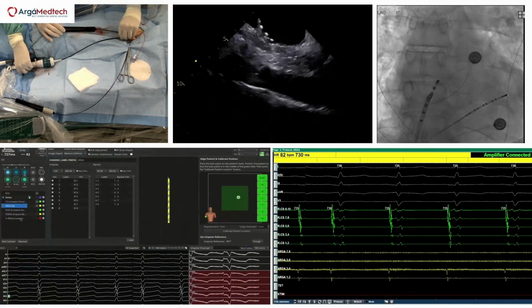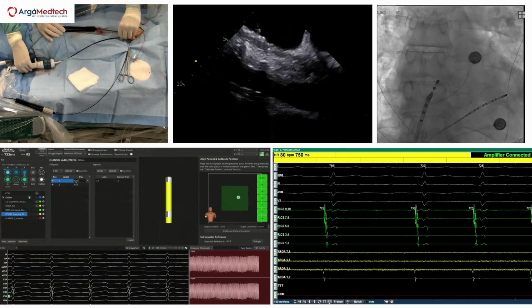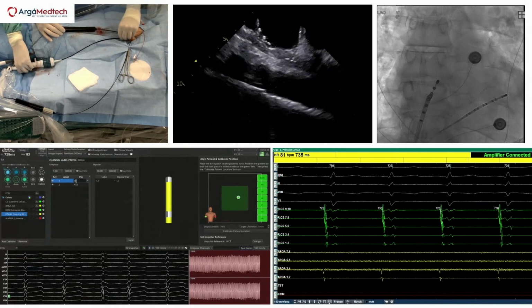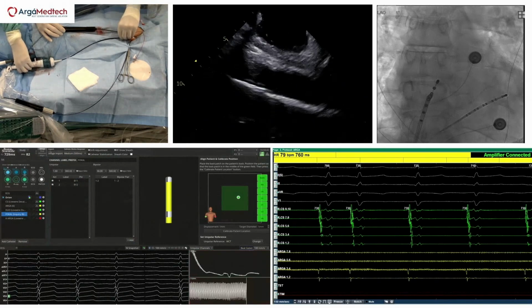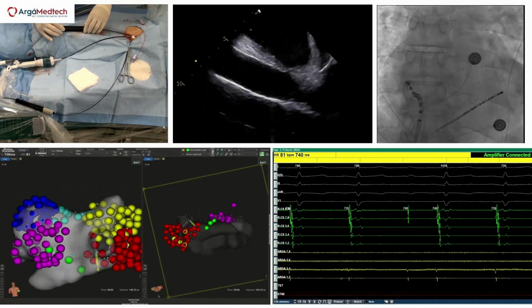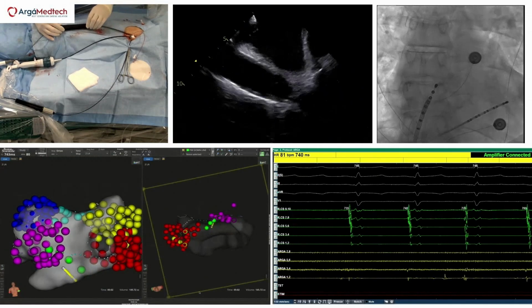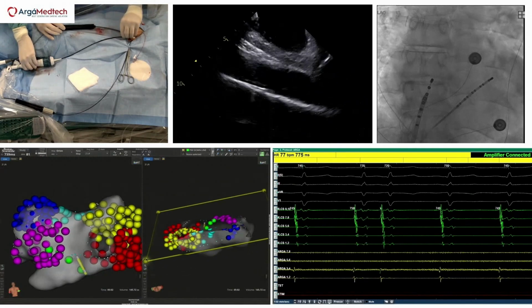Sorry, guys, if you have any questions, go on. We already applied nitro. You already applied nitro for the CTI? Yep. Good. It's in. Thank you, Tony. Now they're changing. Yes. So let's start. Ante, again, remember, we're going to use 8 millimeter tag, Antonio. Let me see contact. Good contact. Point here.